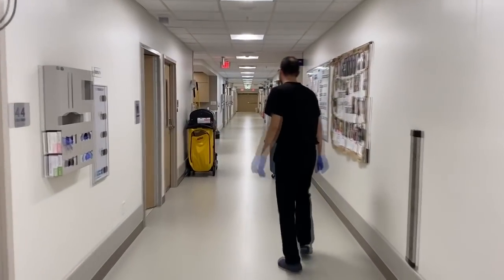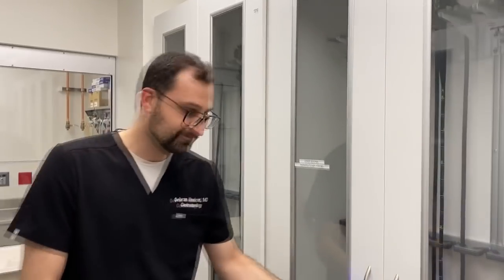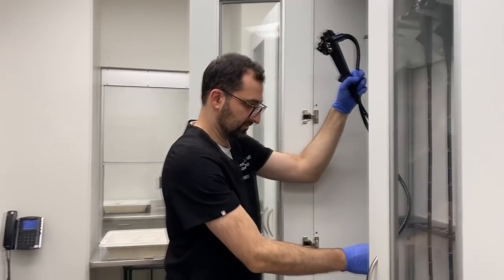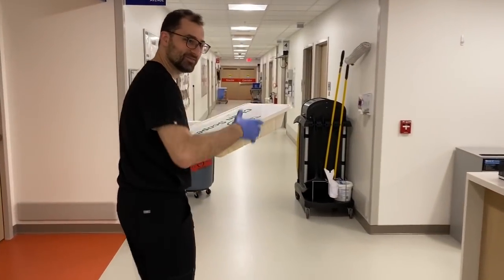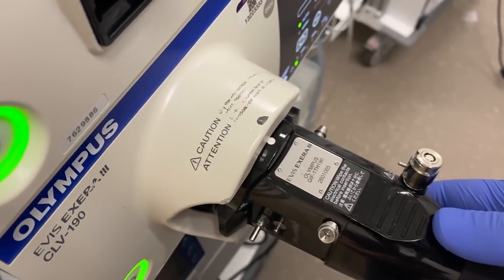So we've got the cart, but we need a scope. We have so many different types of scopes — there's multiple types of EGD scopes, multiple colonoscopy scopes, and ERCP scopes. It's always important to wear gloves whenever you handle a scope. Jabron's got gloves on and he's going to grab an EGD scope, specifically a therapeutic scope for this case. You've got to be really careful when handling scopes because they cost thousands of dollars. Now we've got the scope and we're going to plug it in to the unit.